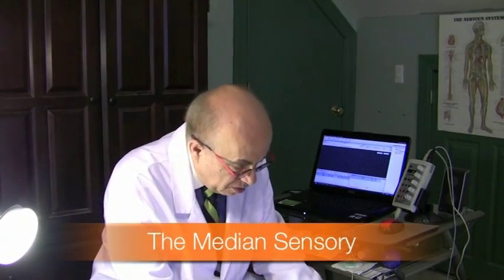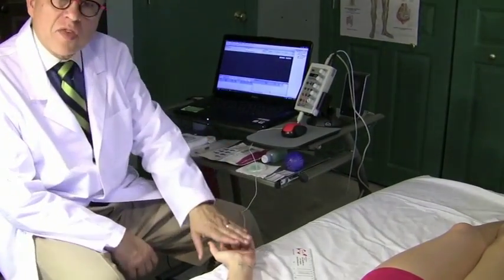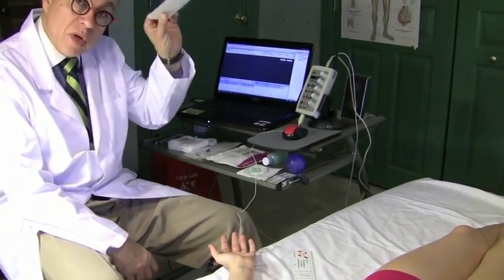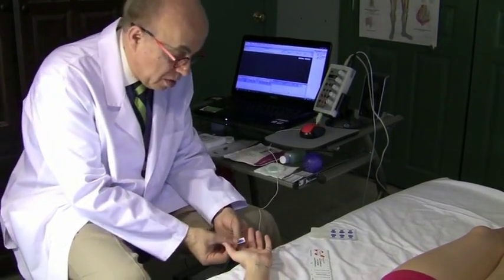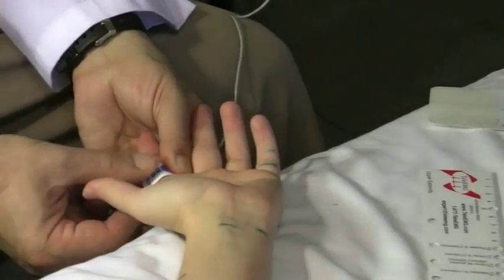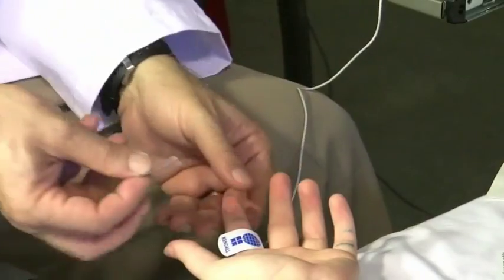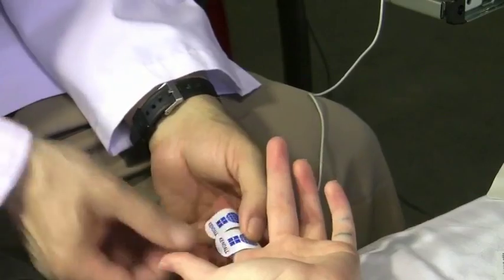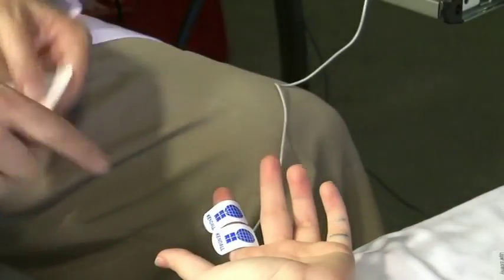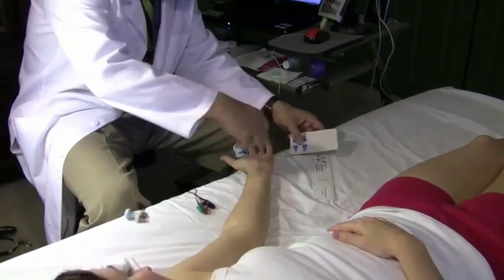All right, so the first nerve we're going to study is the median sensory, and we're going to do the median sensory on the left. So we're going to take some electrodes. These are surface electrodes, and I'm going to put them right where I marked up the spots. This is for the active, that means the black. By the way, you can use the same electrode on the same patient. You don't have to use different electrodes all the time. If they don't stick anymore, you can change them. So active, reference, and then, of course, the ground, which I'm going to put here.